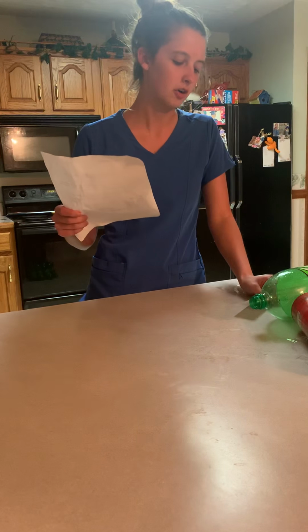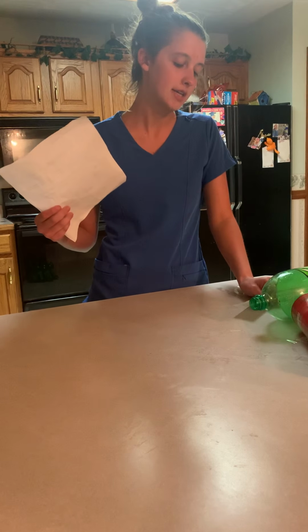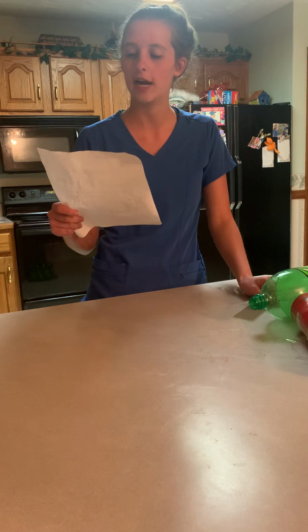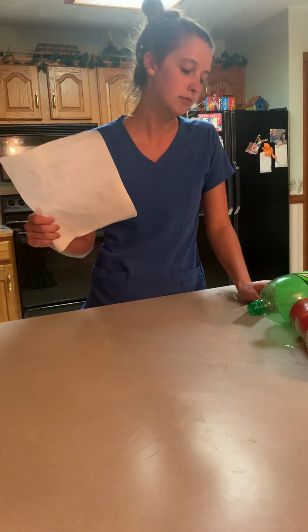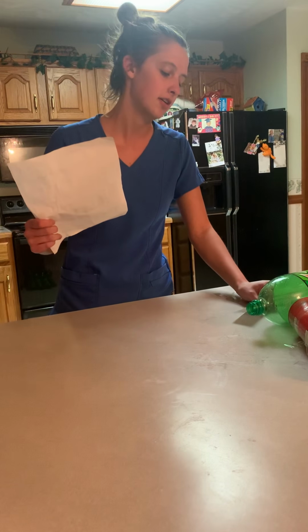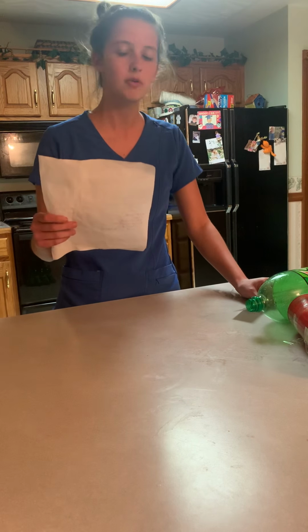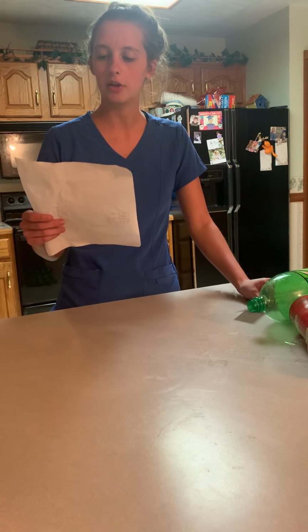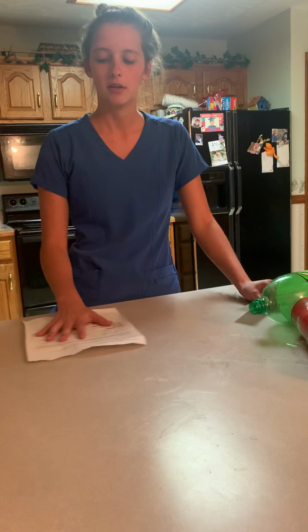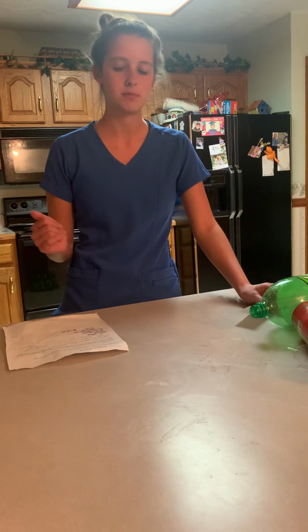The date of birth on the patient ID band is 3/3/83. The date of birth on the healthcare provider order is 3/3/83. The patient ID number on the patient's ID band is 160011180, and the patient ID number on the healthcare provider order is 160011180. So they all match, so therefore it's okay to proceed.